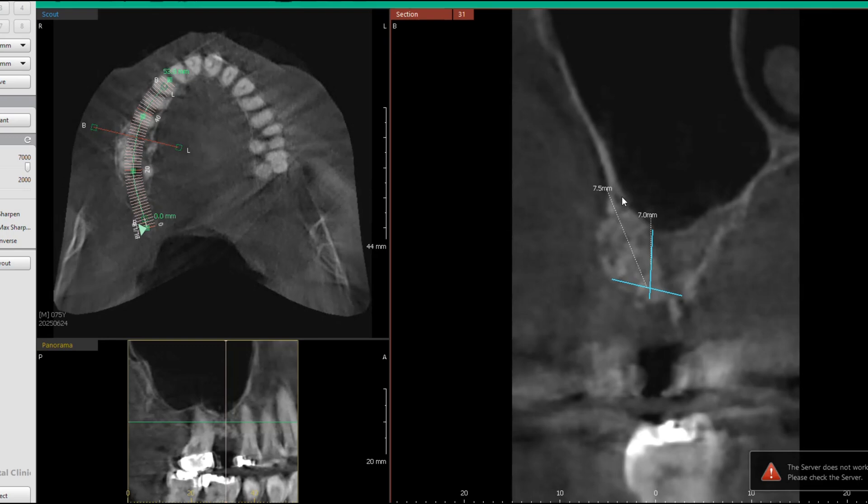This outer edge right here is what we call the buccal side. I had already made an incision on the gums and lifted up the gums on both sides. That allowed me to lift the gum a little higher and easily access this area to create a window so I could go ahead and lift up the Schneiderian membrane. Let me show you an animation of what that looks like.